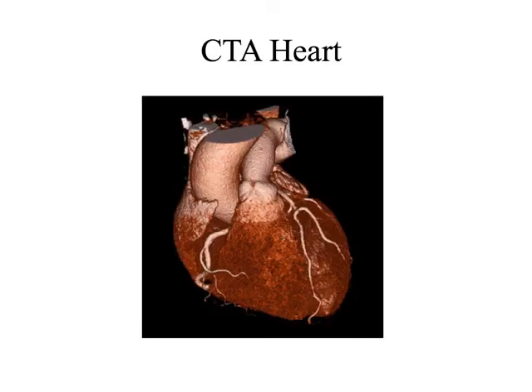So there's a nice pretty picture of a heart. We can visualize them in these three-dimensional images. This is probably done on a TeraRecon station. We can also do MIPs or multiplanar images of the heart, the individual coronary arteries. So it's just institution dependent what they actually want us to do with the data, and the radiologist should be able to guide you in those decisions.